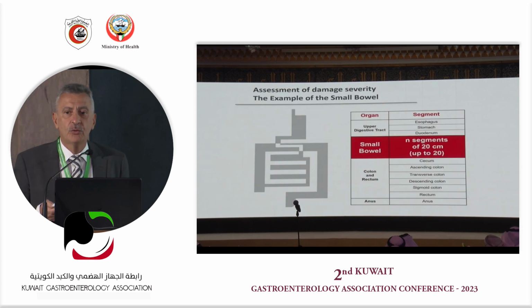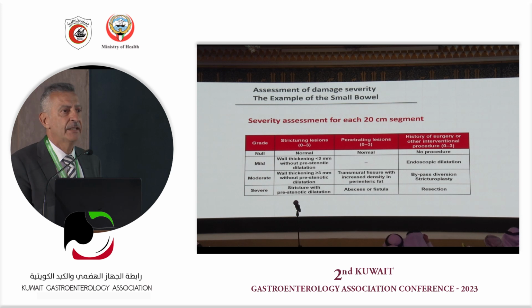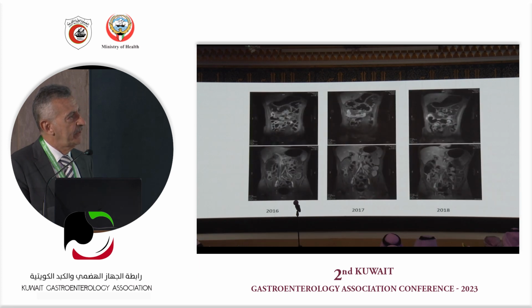Of course, you would also like to evaluate the small bowel damage, in general the bowel damage. This is the Lémann score. That's the best way to do it with MRI. It's a bit cumbersome. And once again, in controlled trials and in comparison among the efficacy of therapies, it can be important. You can see very nicely the evolution during the year of the efficacy of the treatment.